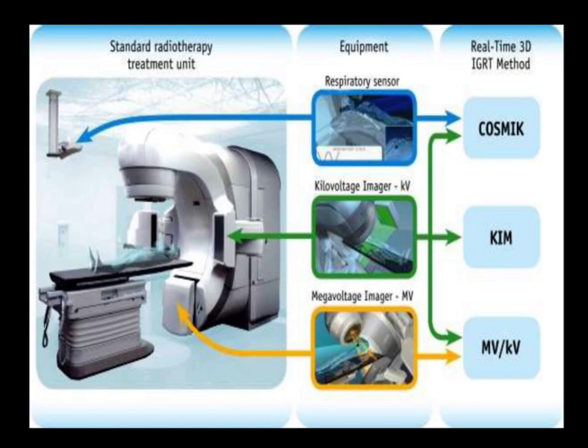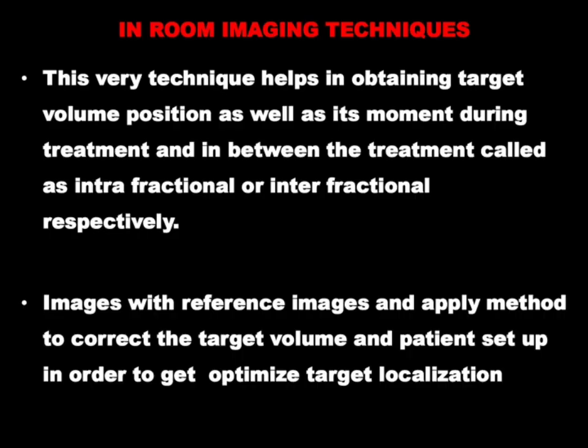So after DRR images on the 3D planning systems, you get the beam's eye view, and you put these blocks and shields on the treatment planning system, and you can adjust the dose as well, and the margins, correction of margins. Actually speaking, imaging has a vital role to play in the concept of modern radiotherapy planning.